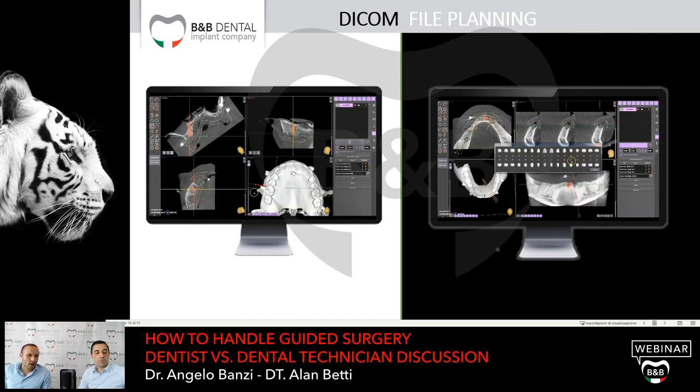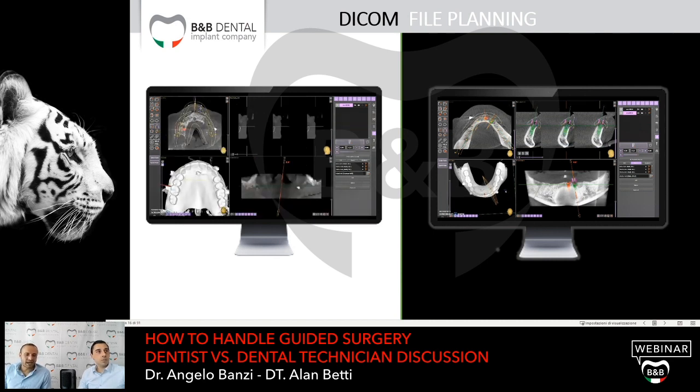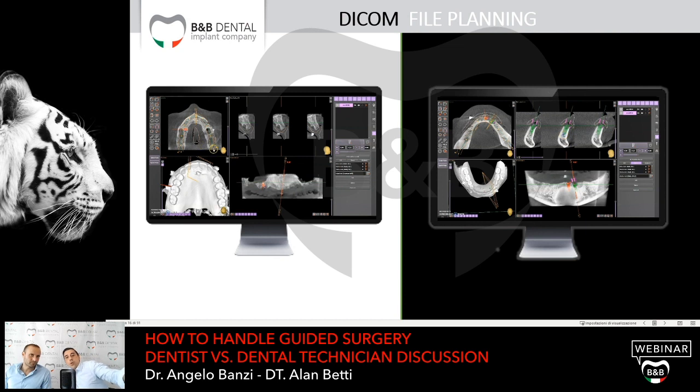I always start by checking the soft tissues, measuring them to have an idea of which length I'm going to have for the abutment. You can do this as in the upper jaw, the panoramic view. You can do everything with our software.